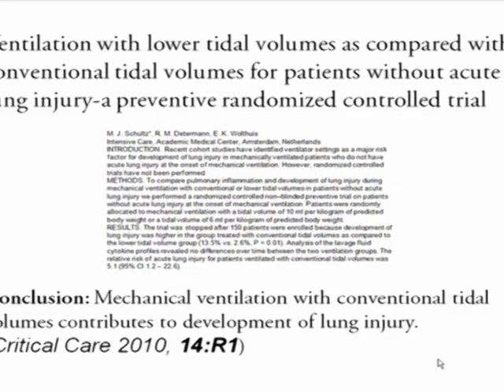And you're saying to yourself, well, what about the patients that don't have obstruction and the patients that don't have lung injury? What about them? Well, I'll tell you, you just treat them like lung injury patients. And I'll tell you why. First of all, the strategy I'm going to show you is applicable to any patient, but I didn't have good evidence to support that. And now finally I do.